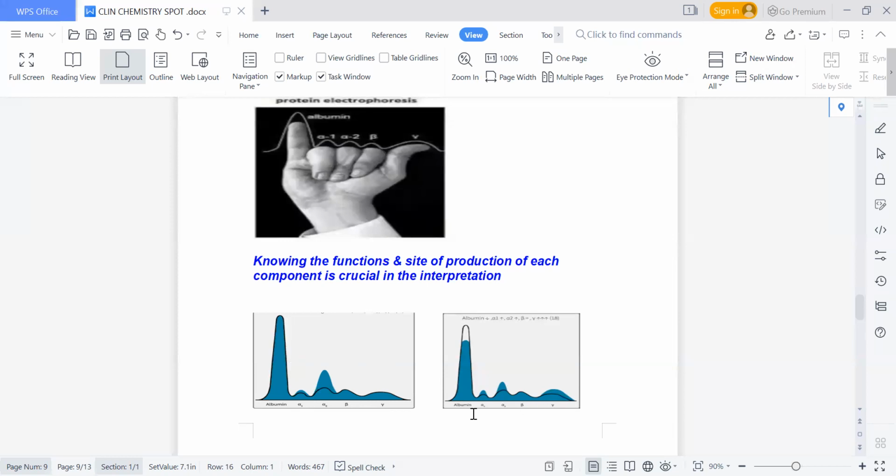In the second clinical picture on the right, albumin is decreased, and not only are alpha-1 and alpha-2 globulin increased, so is the immunoglobulin. So already remembering that alpha-1 and alpha-2 signify acute inflammation, a surge in the gamma globulins together with these two points towards chronic inflammation. In this second clinical picture, the albumin can also be normal. So for the acute and chronic inflammation, remember albumin can be normal or decreased.